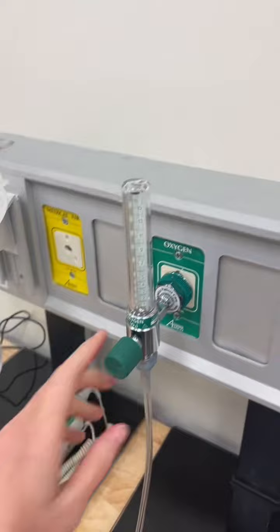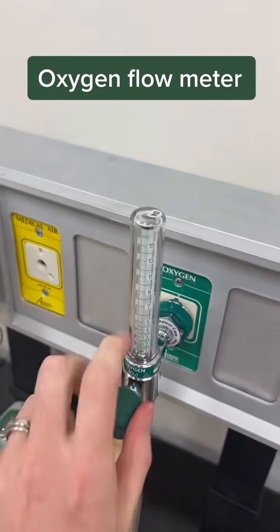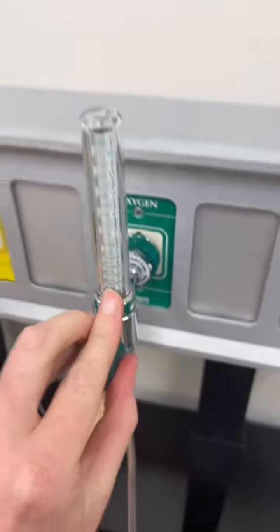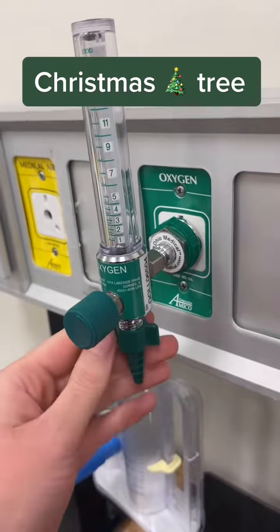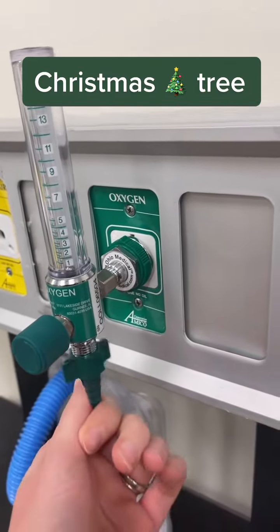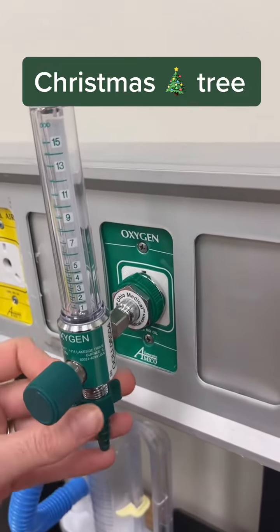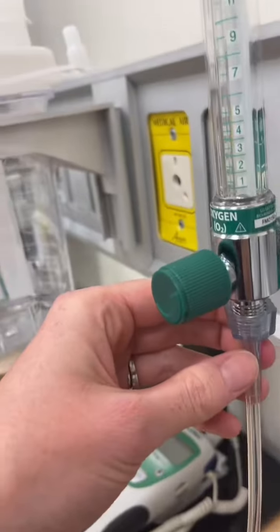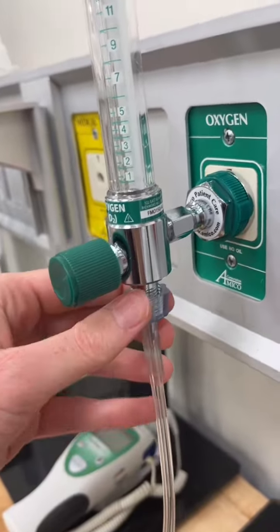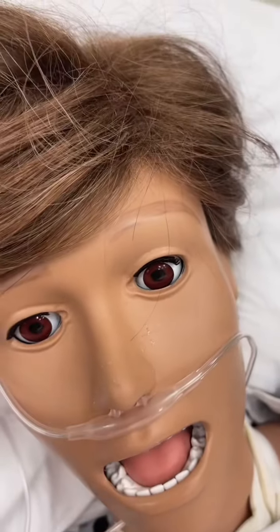Then this is your flow meter for your oxygen, okay? So again, this doesn't work because we're in sim, but there's a little bulby guy here that when you turn it, you just put it to wherever you need it. It may have this, which is called a Christmas tree adapter, which you need to sometimes use to adapt, to put different oxygen devices on here. But this nasal cannula just connects directly to it. You can see that it just screws right on. And then we can trace that all the way to my lovely dummy here and then into this nasal cannula.